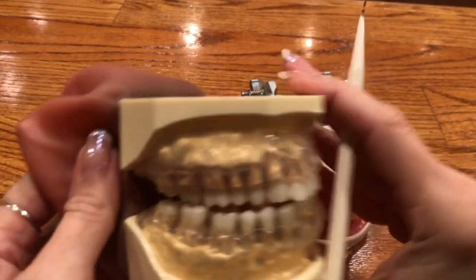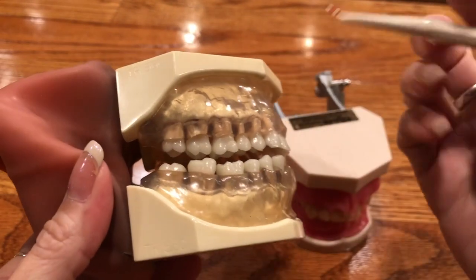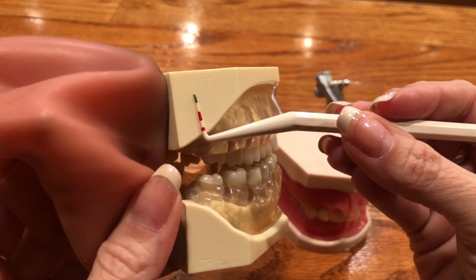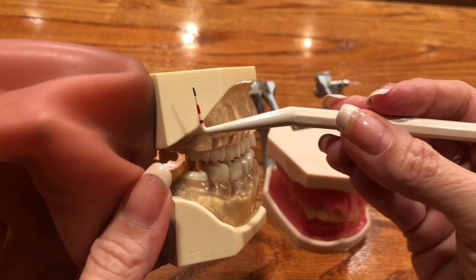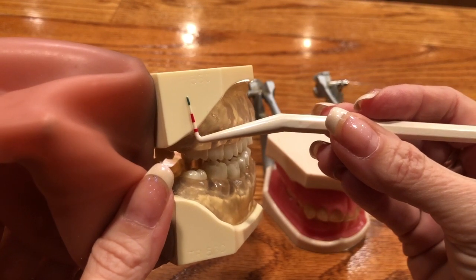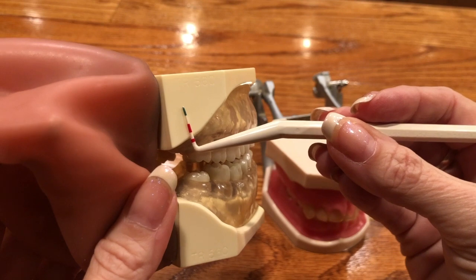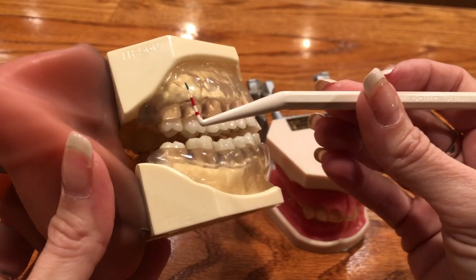So I'm going to show you on this model what it looks like when your dental hygienist is measuring your gum with this probe. This particular probe is color-coded to make it easier for you to be able to see down below the gum line. The green is 1, 2, 3. The white in between is 4 and 5. And when you get to the red here, it's a 6. And then it goes 7, 8, 9, 10, and down below. So if you have numbers that deep, that's probably not going to be good.